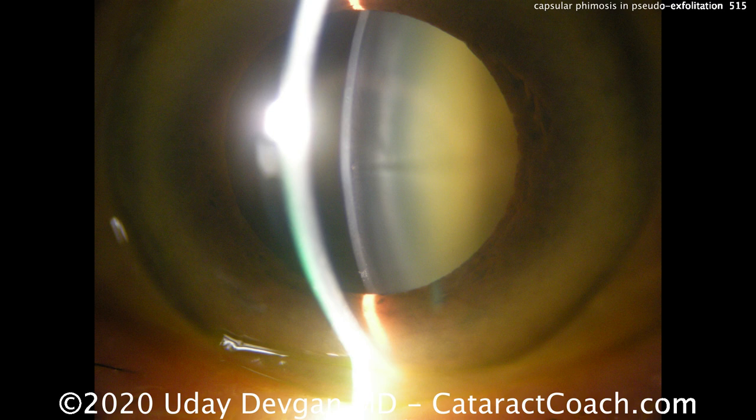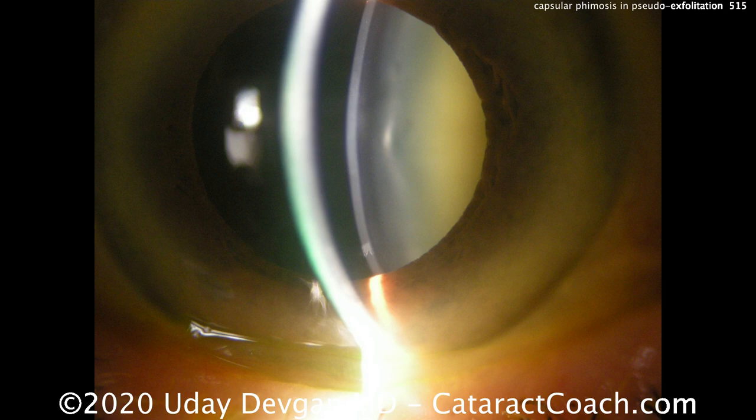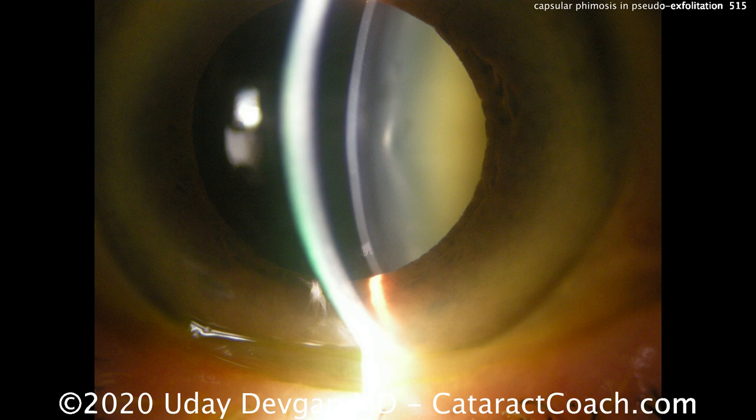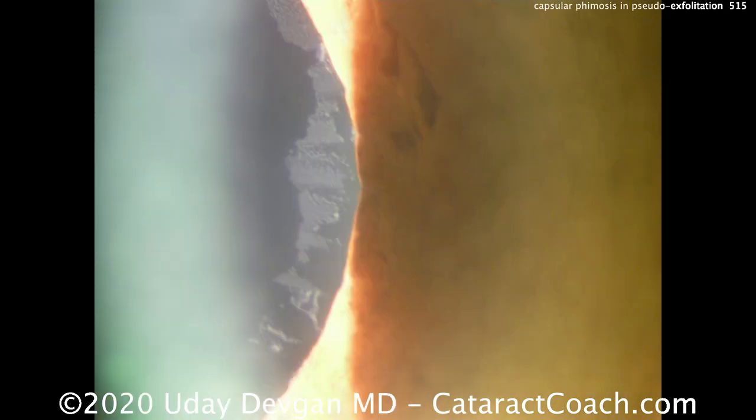What other clues do we have before we do surgery on this eye? Let's look a little bit more carefully. Look at the gap between the reflex off the anterior lens capsule versus the cornea — that gap is the anterior chamber depth, and it's less than two millimeters. Now zooming in, what do you see there? This fibrillar material — that's pseudoexfoliation. We know that material causes not only poor dilation, but also weakness in the zonular attachments.